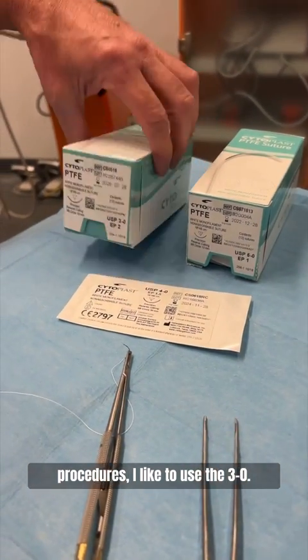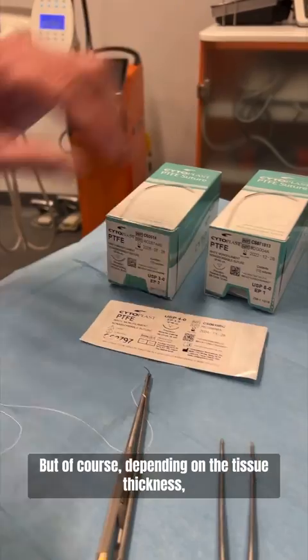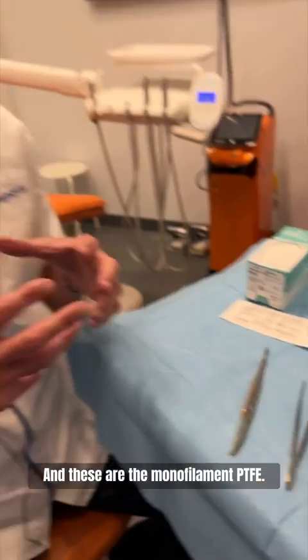I like to use the 3-0. They're a little bit thicker and they really maintain the flap together well. But of course, depending on the tissue thickness, you can go to smaller sizes like 4-0 or 5-0 — these are the monofilament PTFE.